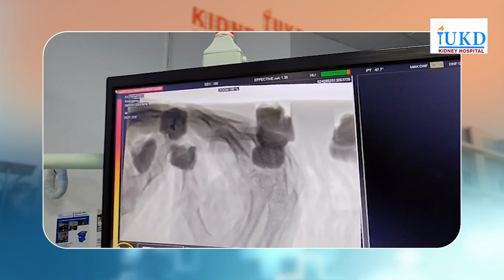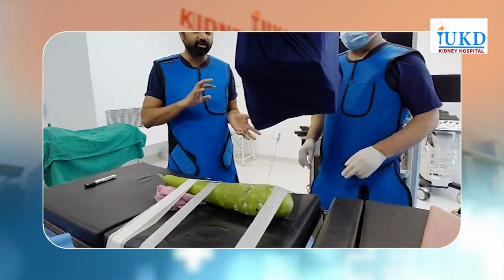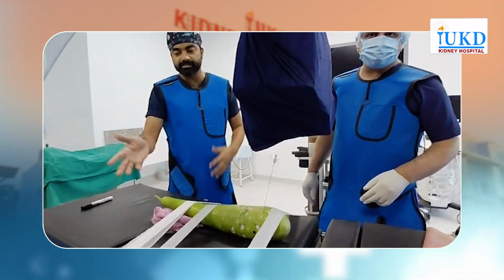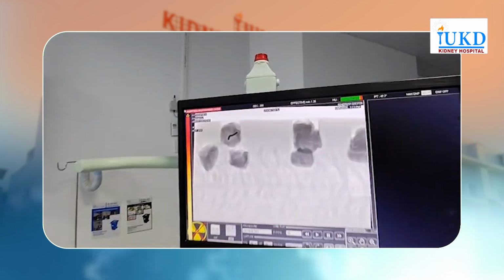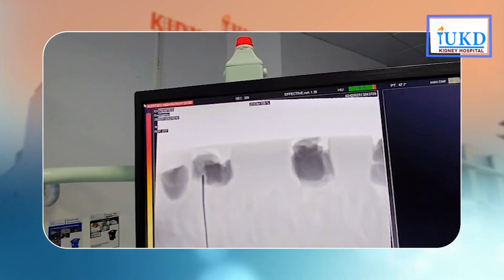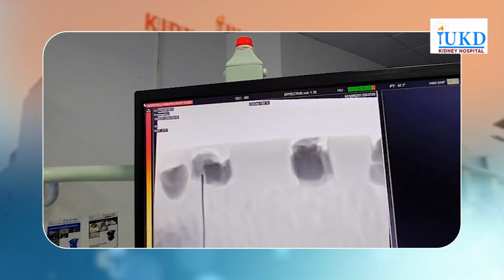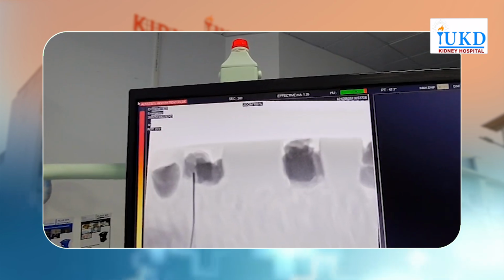Okay. Go deeper. You will feel that you're not sure whether you have crossed or not. Make it 0. Try to see where you have reached. Take a picture. A little behind you. Oh, so you are just at the calyx. So it was the previous one which you were trying, right? Posterior one. You are right at the calyx.